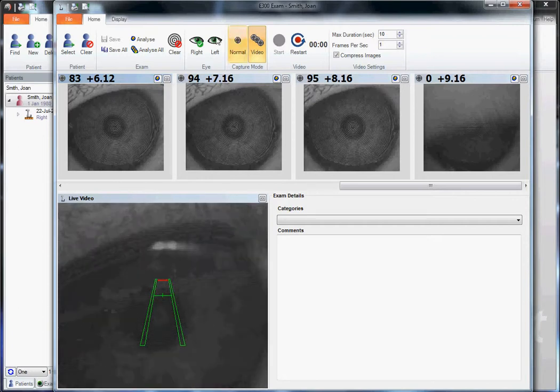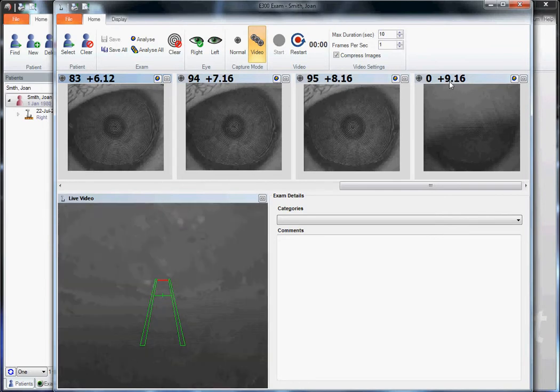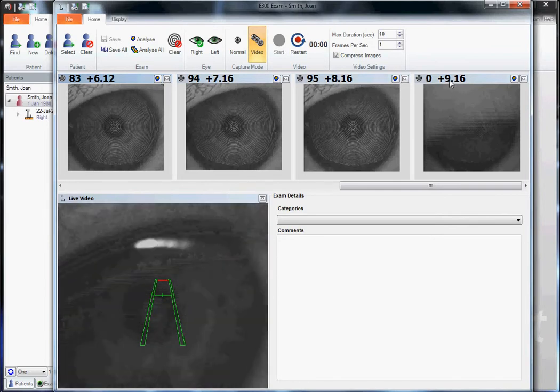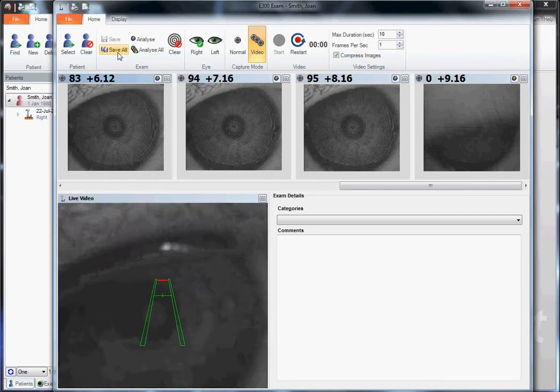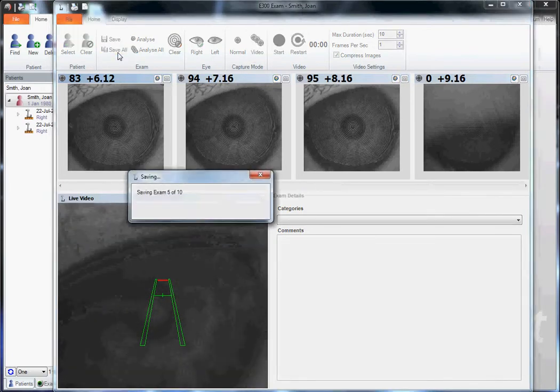You can see that in the images above, up to plus nine seconds. Then we can save all these images by clicking save all.